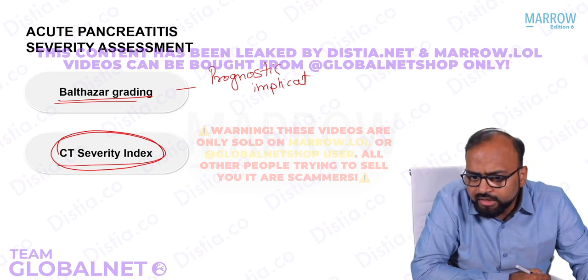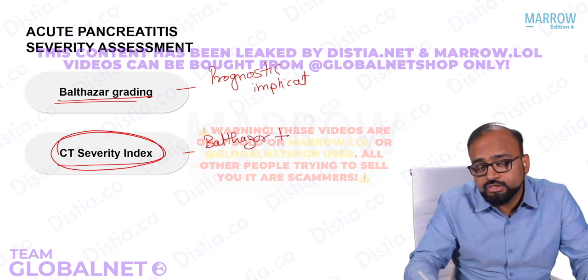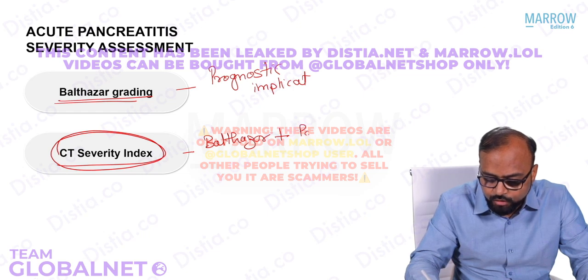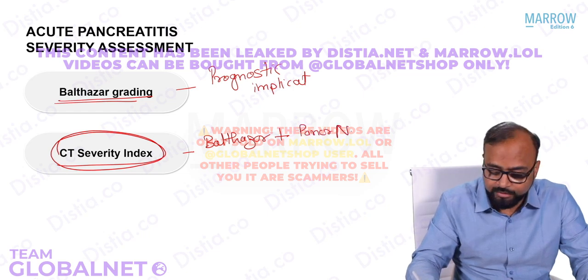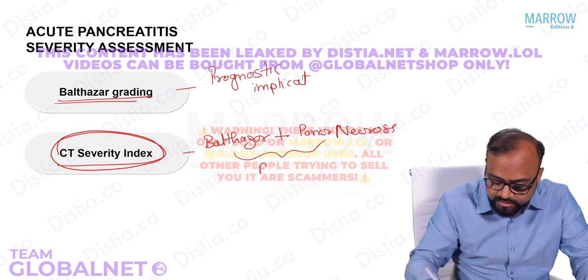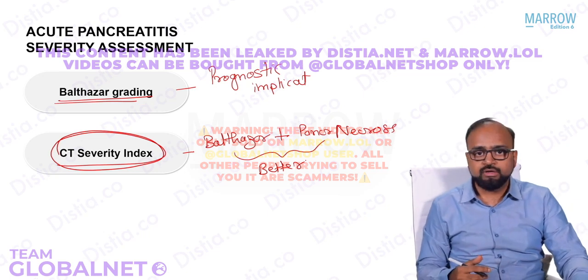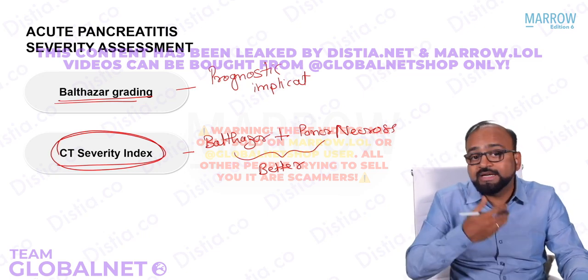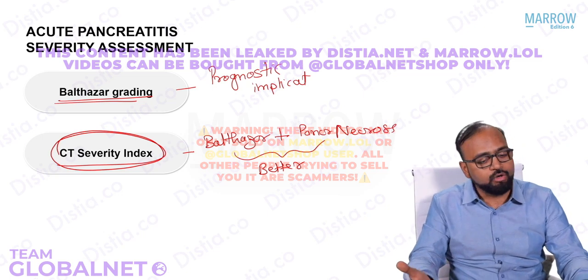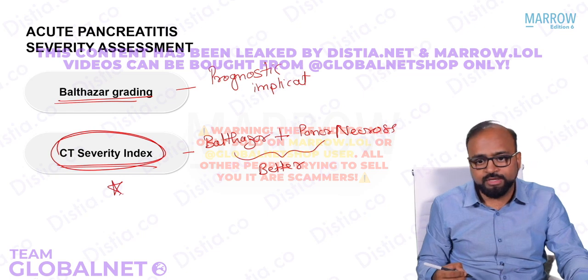So CT severity index basically includes the criteria of Balthazar, plus it includes the presence or absence of pancreatic necrosis. And therefore, because it involves both of them, it is considered to be slightly better as compared to just Balthazar grading, and it has a better correlation with overall mortality and morbidity in pancreatitis patients. So CT severity index is considered to be better.